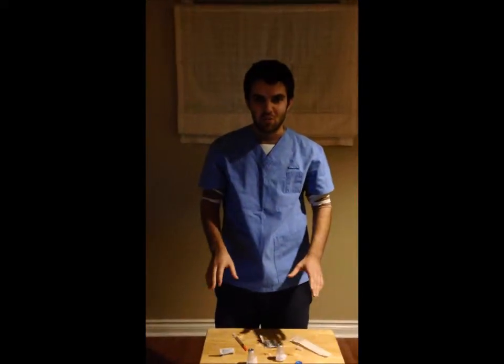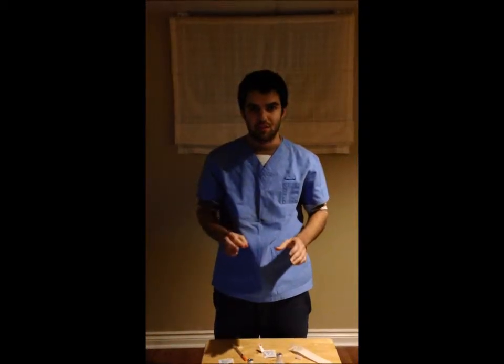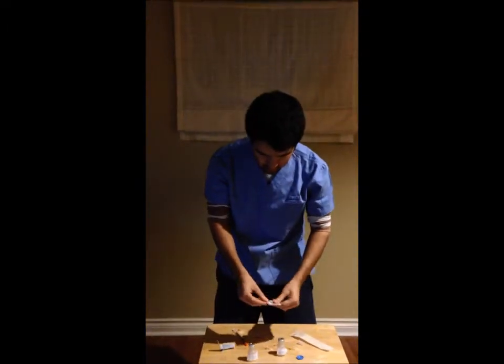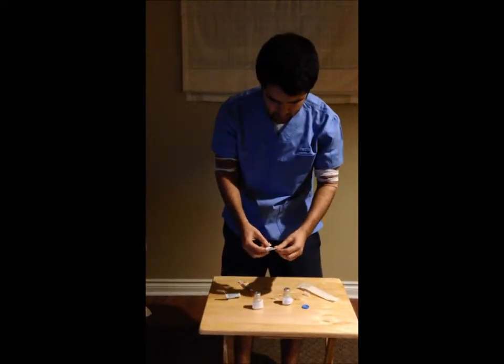So I'm just redoing this so I can show clearly how much insulin I'm drawing up into my needle. So I'm just going to redo the asepsis technique and reconstitution. So first I'm going to swab the tops of both insulins.